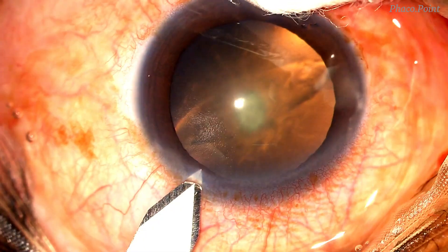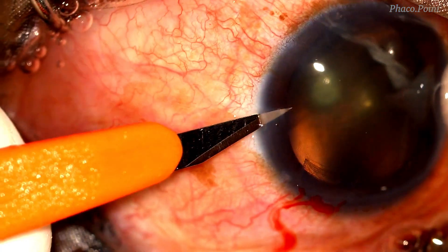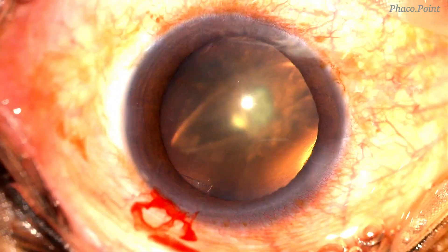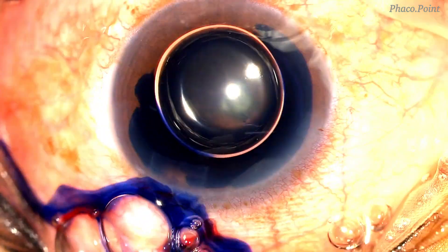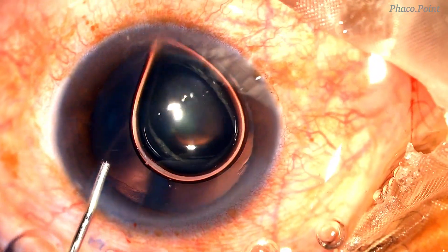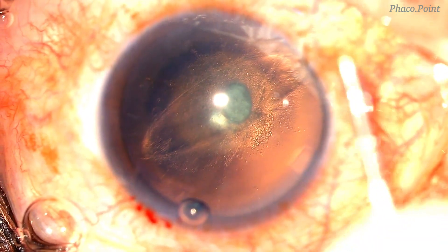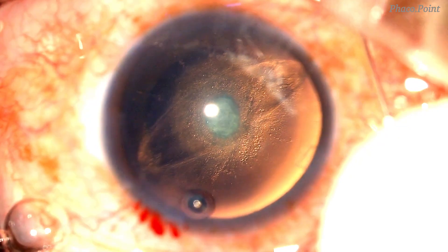Care is taken while creating the 2.8 mm tunnel as well as both the paracentesis incisions. This is followed by the staining of the anterior capsule with blue dye, with a view to enhancing visibility whilst performing the rhexis. Following the staining, viscoelastic is introduced into the anterior chamber to deepen it and flatten the anterior capsule prior to performing the capsular rhexis.